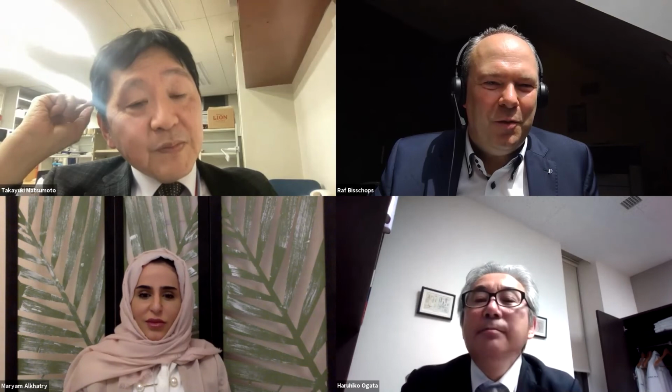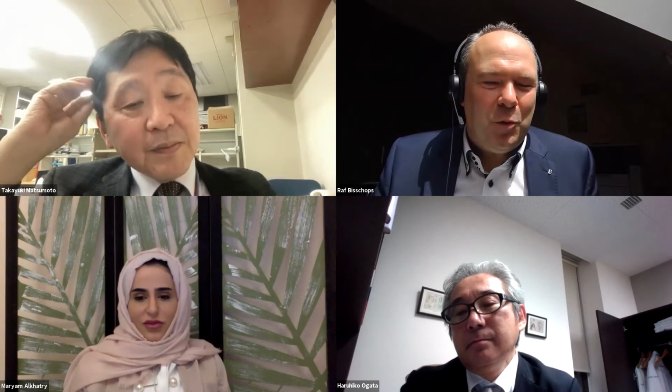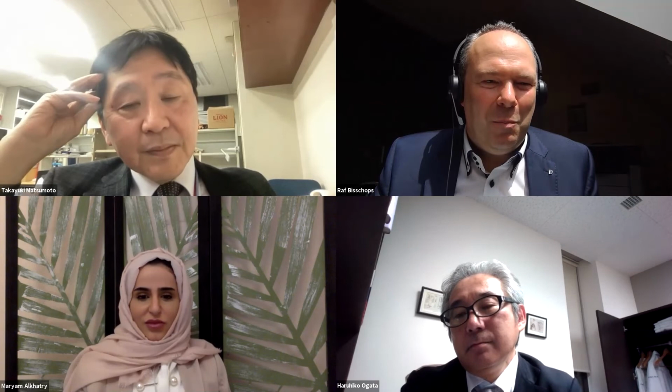With ESGE, we have proposed a training schedule for that. We suggested visiting somebody like you with a lot of experience for at least a week to see some cases, and then in the first 20 cases to have backup random biopsies when they start doing chromoendoscopy. Do you think that makes sense or not? Yeah, I think that makes a lot of sense. First of all, we have to experience how the dysplastic lesions look. That's very important.